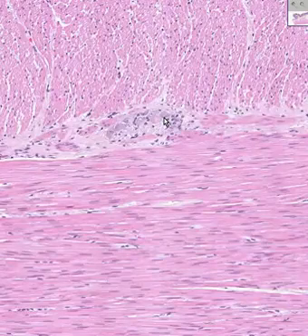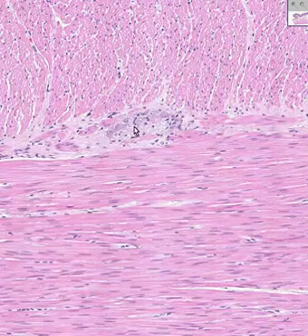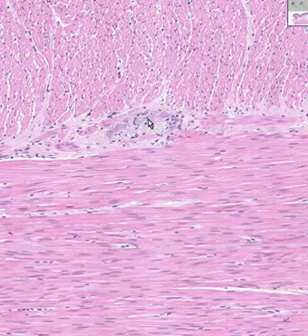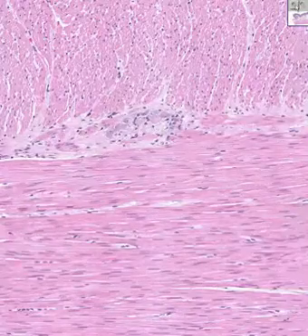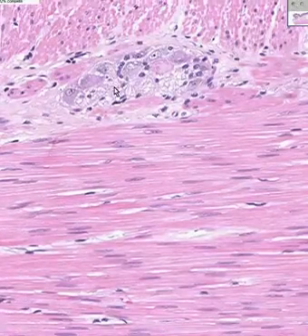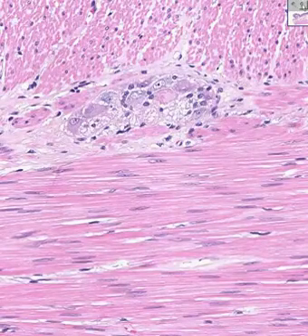This is the myenteric ganglion of the gastrointestinal system. That's where these are found. They're quite common. Another place to find ganglia, almost like a separate brain of the GI system, is in the, let's go back to that. These are nerve cells of the myenteric plexus.